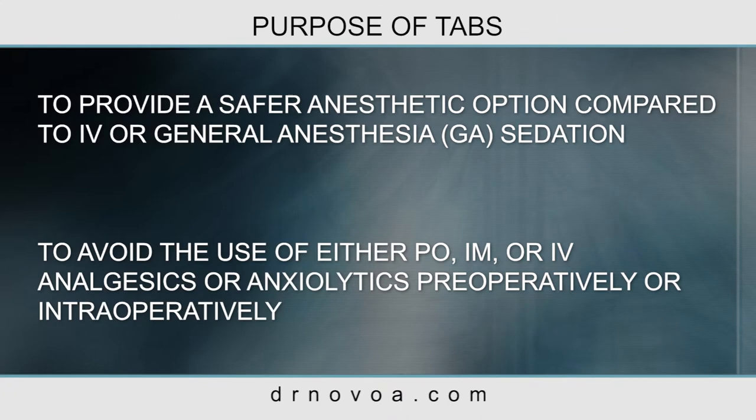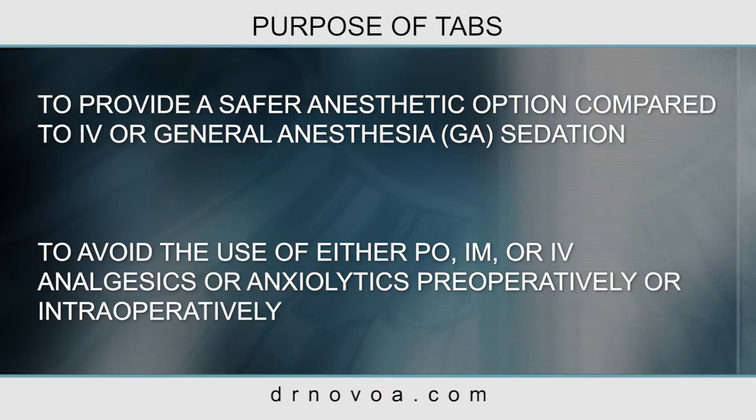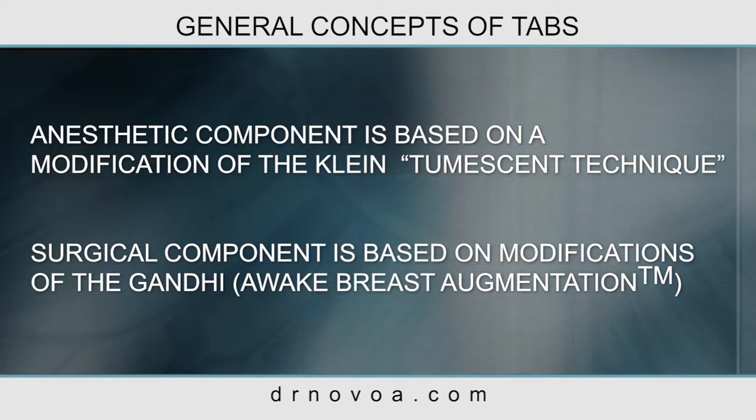The purpose of TABS is to provide a safer anesthetic option compared to IV or general anesthesia and to avoid the use of analgesics or anxiolytics preoperatively or intraoperatively. TABS is based on the merging of two general concepts: the anesthetic component, which is based on modifications of the Klein technique, and the surgical component, which is based on modifications of the Gandhi AWAKE breast augmentation technique.